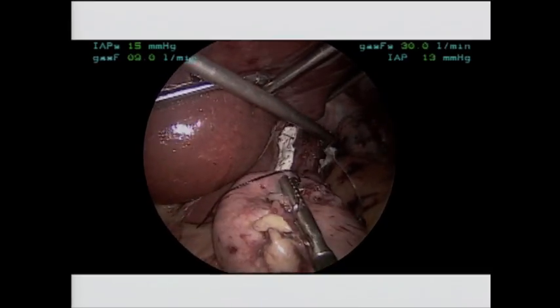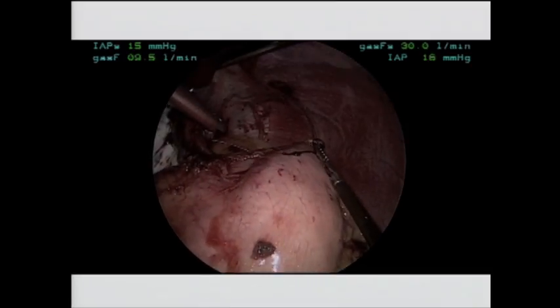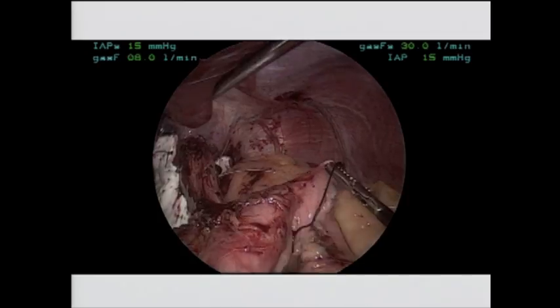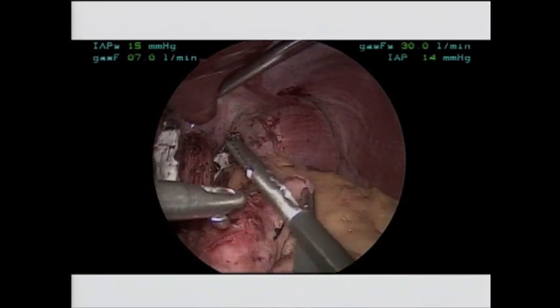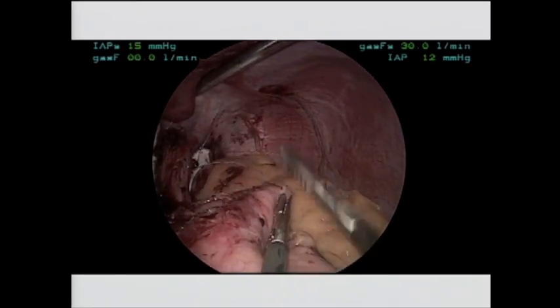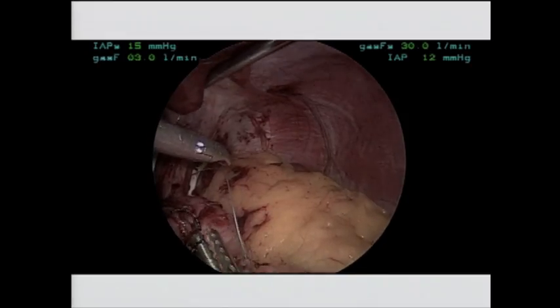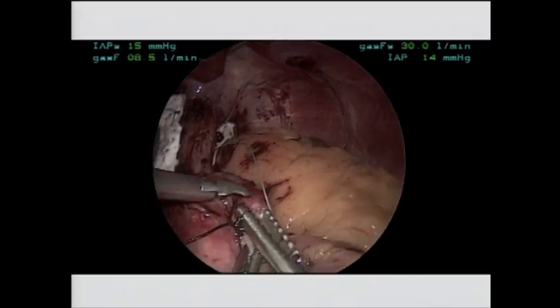and simply stretch all this back out to the patient's left side so we can make a point on the front of the stomach. I didn't used to do this, but now what we do is we're actually going to stabilize that area, let go with a retractor, and simply flip it over so we don't lose the length it took for that suture to cross across the front there. You'd obviously give up 3 or 4 millimeters if you did that. And we simply re-grab the same point, stretch it out. We're going to make that same triangle on the front side here.